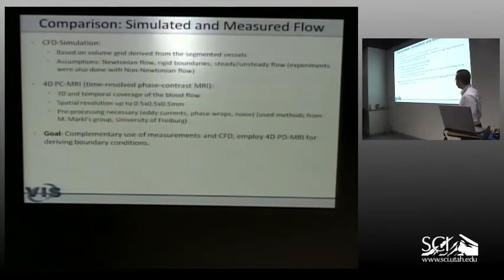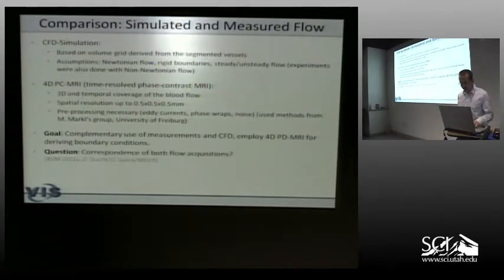At least in my perception, the group from Michael Markl in Freiburg is the leading group in the acquisition of such measurements, and they also came up with a nice MATLAB toolbox where they corrected most of the artifacts. So basically we have re-implemented their tools in order to make use of such measured blood flow data at all. So we have investigated how well both correspond to each other, at least for a few phantom studies.